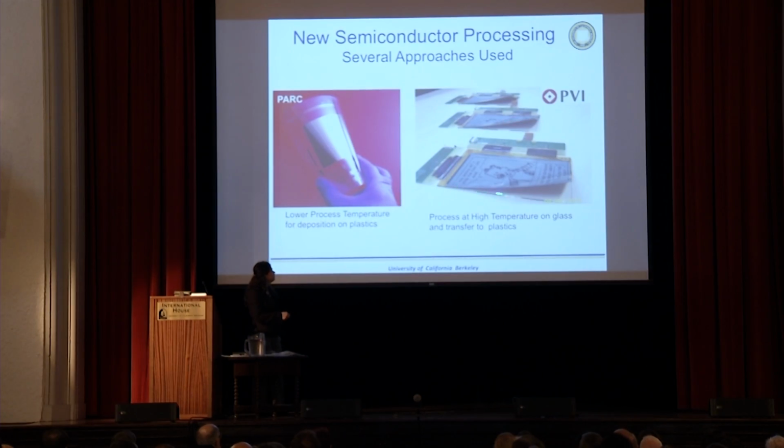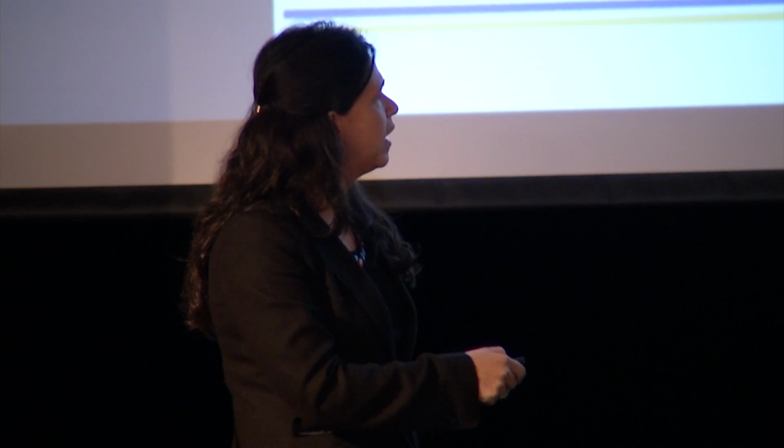And we start seeing displays that are flexible, that also have the front plane, the display media, that is also flexible. This is now done by PVI, and in fact, our e-reader books have the flexible backplane and the flexible display. Everything else is rigid, the drivers are rigid, but the display is now flexible.